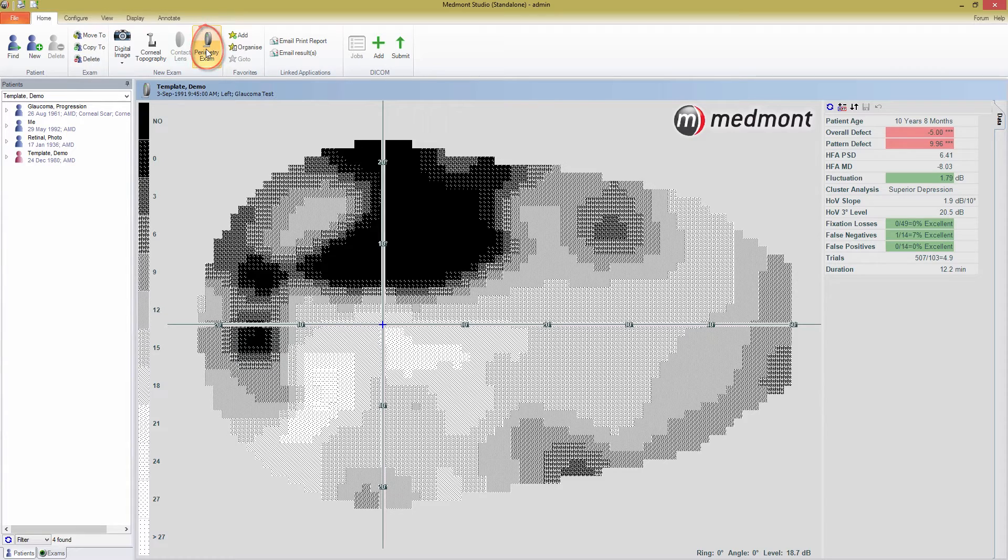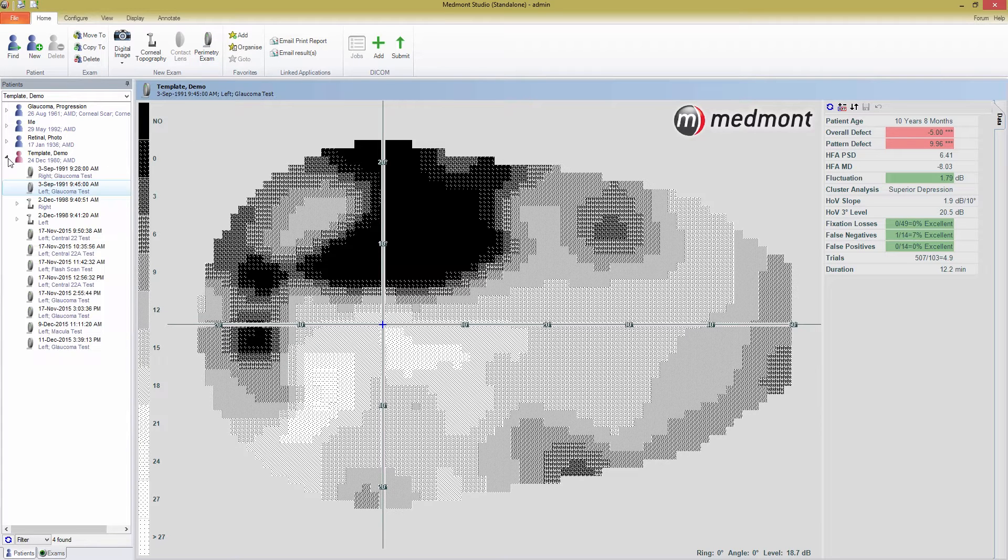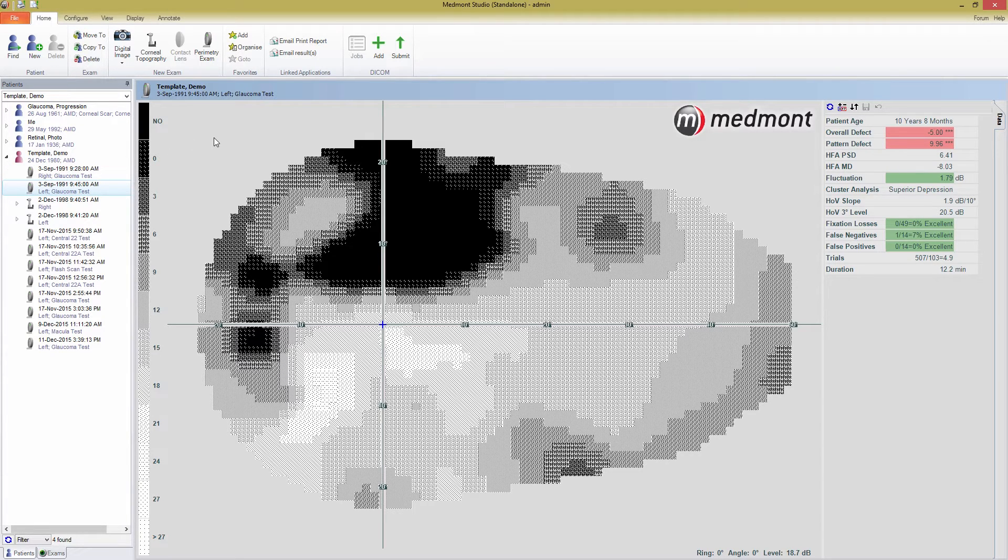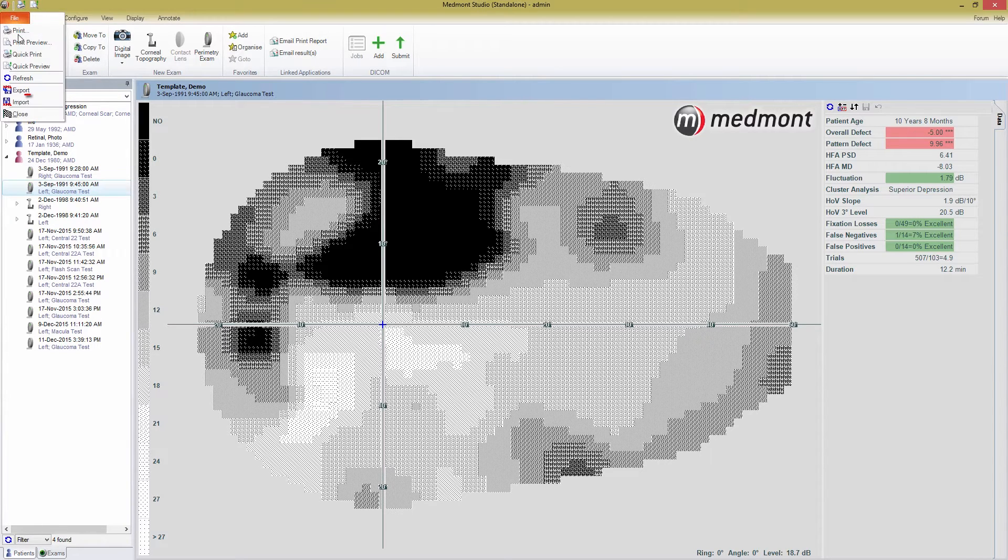If you are using the BOL simulator, please select a pre-existing exam for the simulator to work with. You can download both the simulator and a package of sample data from the support page of the Medmont website. The link to that page is in the comments of this video. Once downloaded, simply press File, Import, and browse to the sample data to import it.